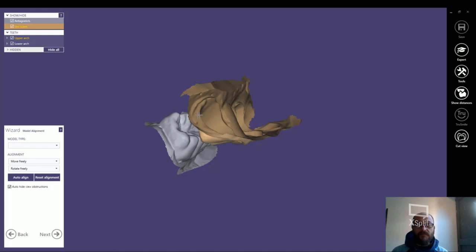As you know, Shining 3D's desktop and intraoral scanners are fully integrated with the Exocad system, so no problem at all for Shining 3D customers. And then these models can be made in the traditional way with removable dies, or on a prefabricated pinned base. Let me show you how to set a prefabricated pinned base.